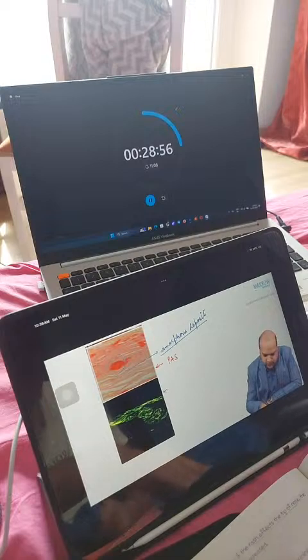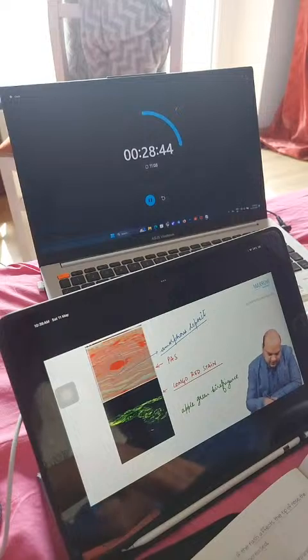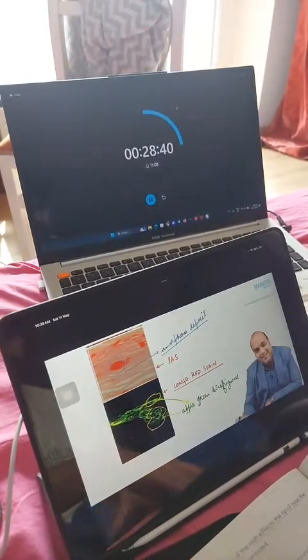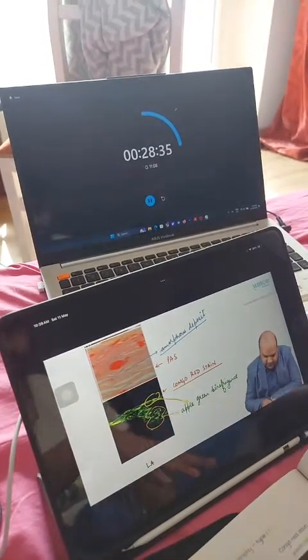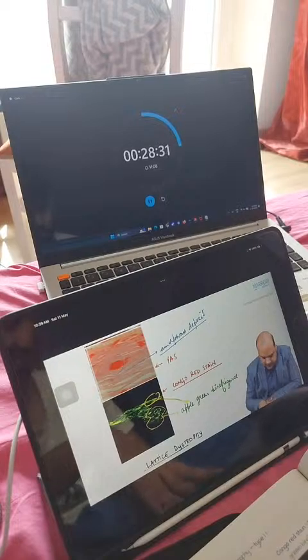I hope you can see Congo red stain. Congo red stain, amyloid. I hope you remember from your pathology. Will give what, everybody? Will give an apple green birefringence. Yes. So these areas, everybody, you can see these are all amyloid deposits after getting stained on Congo red stain. Yes, thus making our life very easy, and we are able to very easily diagnose these as a case of lattice dystrophy.